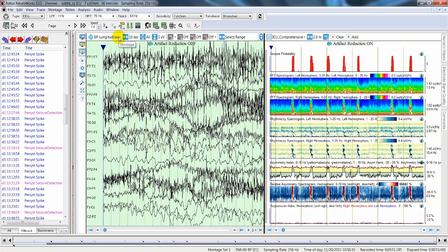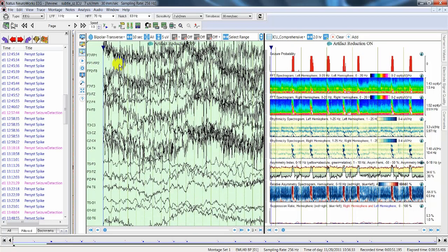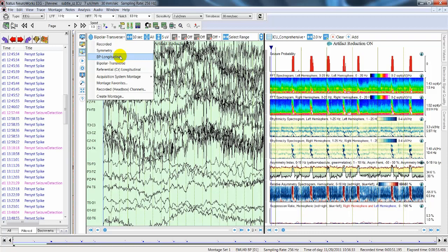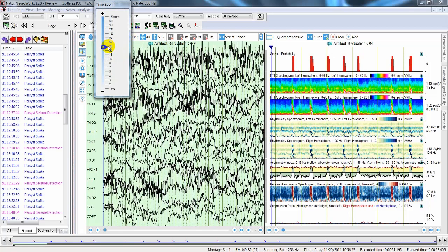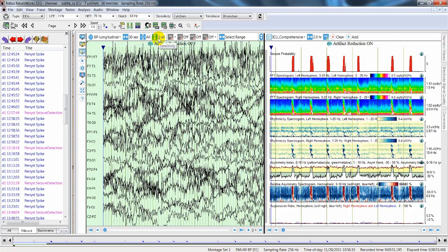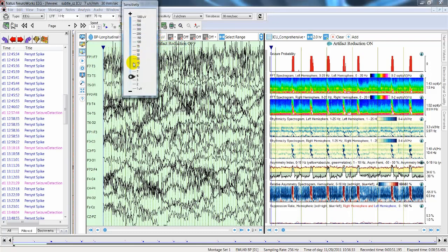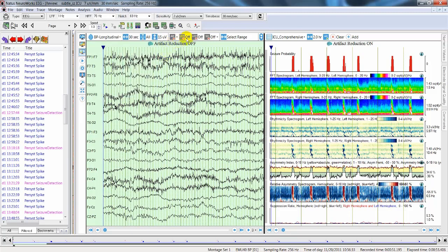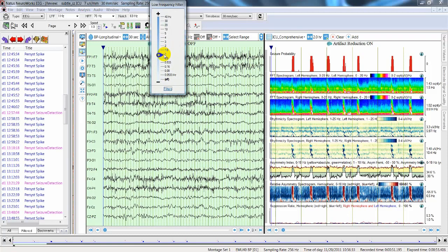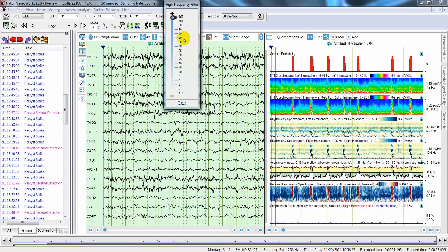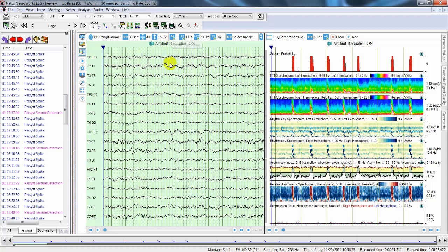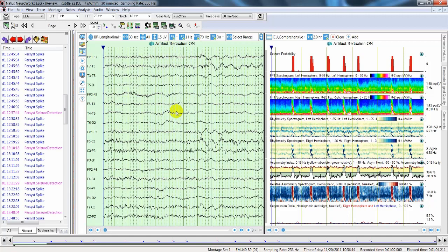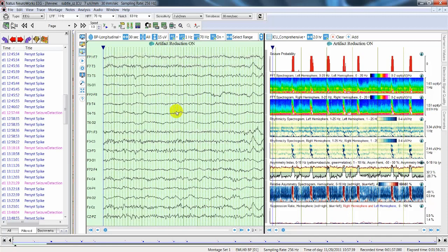In the EEG view, you can click on the montage box to select the montage to display. Then you can set the visualization parameters, for instance the time base, the sensitivity, the low filter, the high filter, and the notch filter. By clicking on the AR button you enable the artifact reduction, which detects and reduces physiological and electrode artifacts. You can mainly see the effect on the first two traces, where the original signal is shown in the background in a grey color.